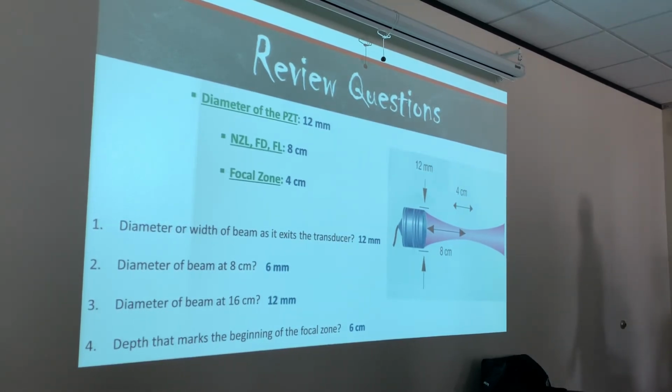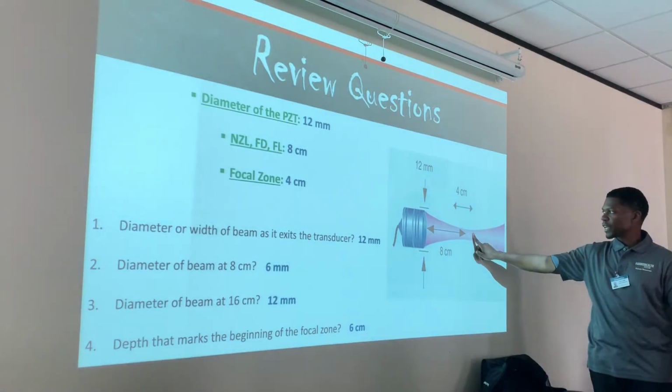Think about it. What depth marks the end of the focal zone? 10 centimeters, right? Our focal zone ends right there, right?